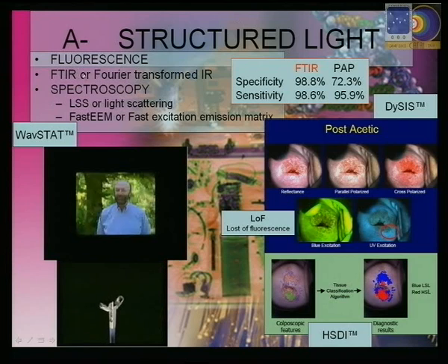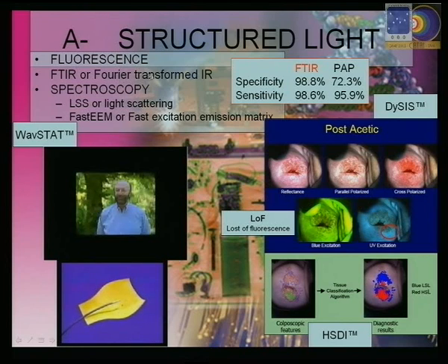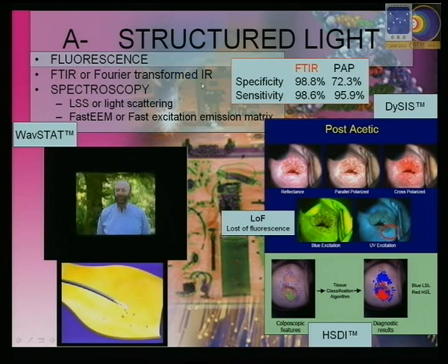Another very important application, which is non-image based, so it's based on the Fourier domain transformation curves obtained by exciting the area with infrared.